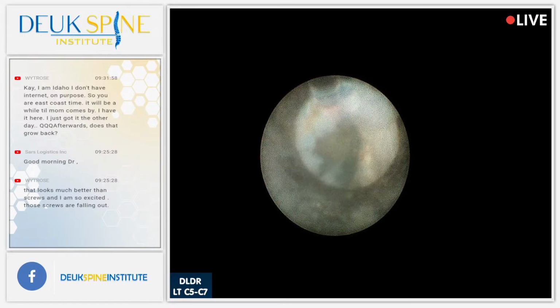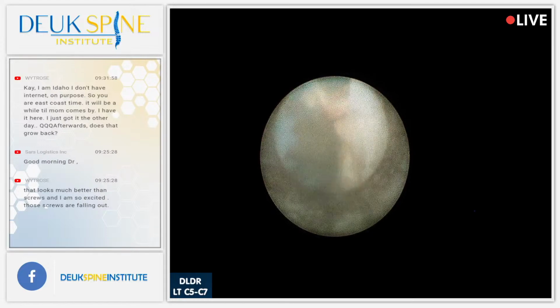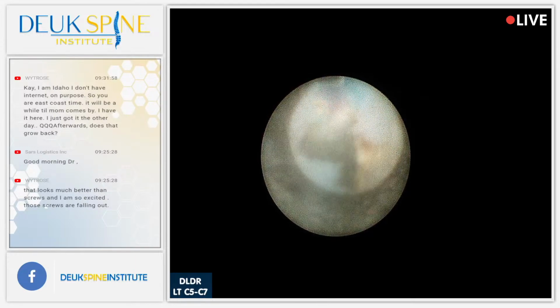And there's the tear. You see the blue? The blue highlights the tear. That's why we do the blue dye. It shows us the tear. It shows us the herniations. It shows us the degenerated part of the disc. That's a bone spur right there. I just blasted it away. All right, do we have any questions?